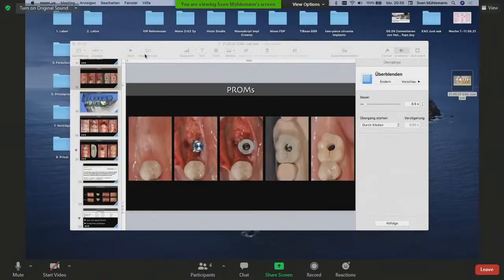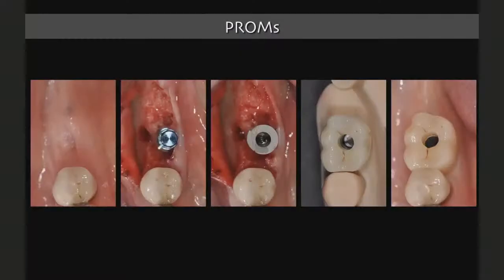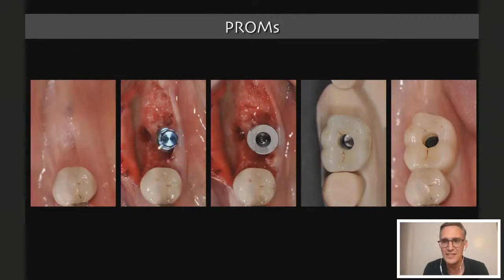Well, it depends. In the case that I showed already, maybe I'm going to share it again. Yeah, please show me. Here I used a scan body made out of titanium. So there are scan bodies where, when I take a radiograph, I can check the proper seating of this scan body.